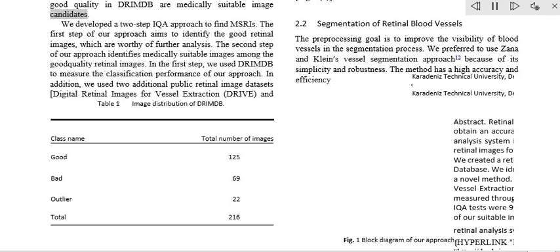Pre-processing. The visibility and clarity of blood vessels play an important role in assessing the retinal image quality. We applied image processing techniques to retinal images in order to enhance the visibility of blood vessels. Retinal images are generally stored in JPEG files using the RGB color space. According to many works in this area, the green channel of the retinal images contains the most valuable data because of its informative contrast rate. Hence, we extracted the green channel of the retinal image initially, Fig 2a.